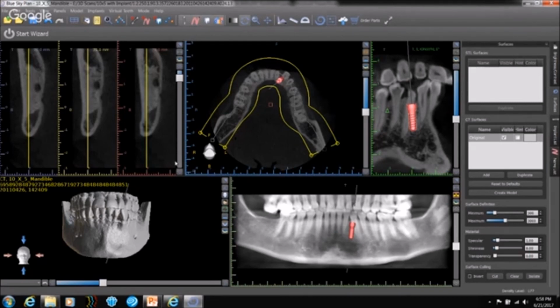Okay, here's another comment that just came in. Sometimes I find empty spaces in the mandible. Can you please show us an example of focal defects?